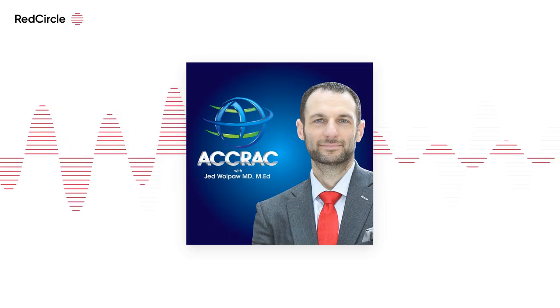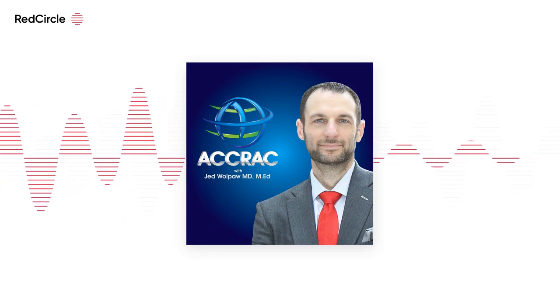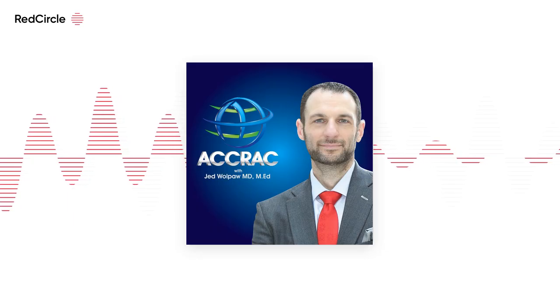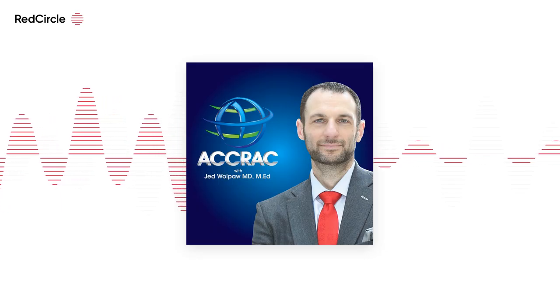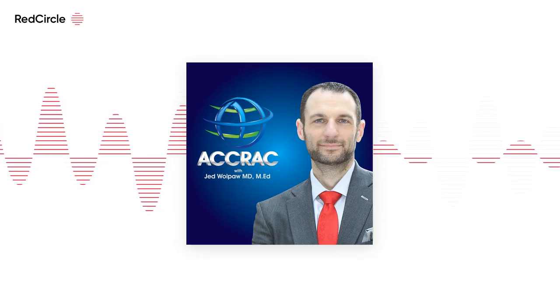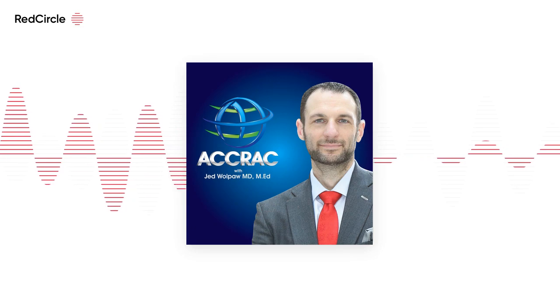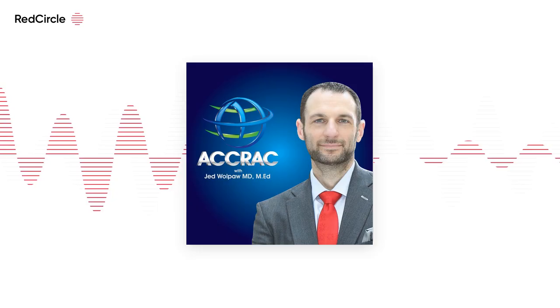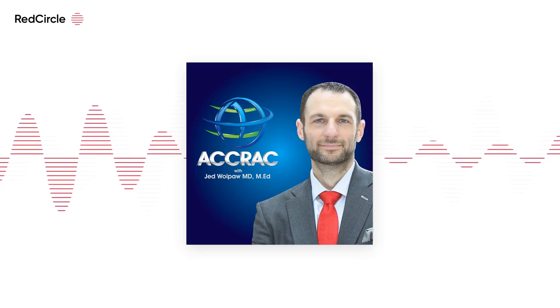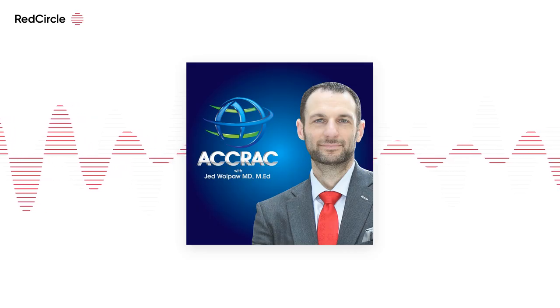In fact, at the hospital I used to work at, every patient with a PF ratio less than 200 got an esophageal balloon and a full respiratory system mechanics workup. And what they found after publishing years of data was that driving pressure was just as helpful in identifying survivors and non-survivors as any measure of transpulmonary pressure related to lung stress and strain. Whether it was directly measured inspiratory transpulmonary pressure or the elastance-derived method, which better reflects the baby lung, driving pressure was just as good, if not better, to indicate potential for injury. So is there still use for esophageal pressure? I know I'm rambling now, but I believe so.